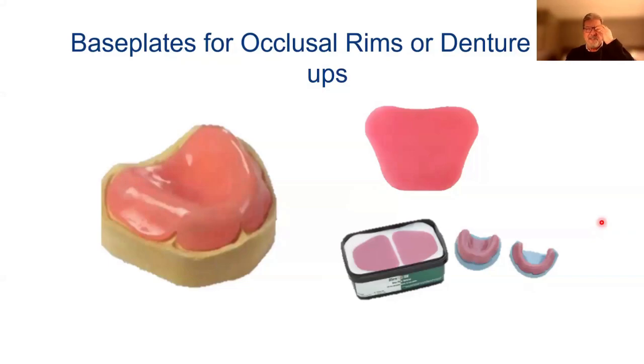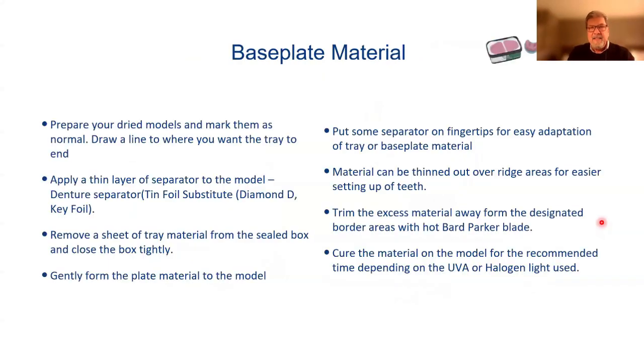So base plates for occlusal rims and denture setups. Same technique I used before. I'm using the SternTech base plate material now. I'm going to apply a thin layer of separator. I'm going to block out any major undercuts on the model. I'm going to adapt that by putting some separator on my fingers.